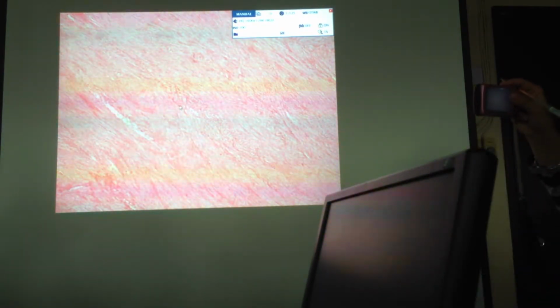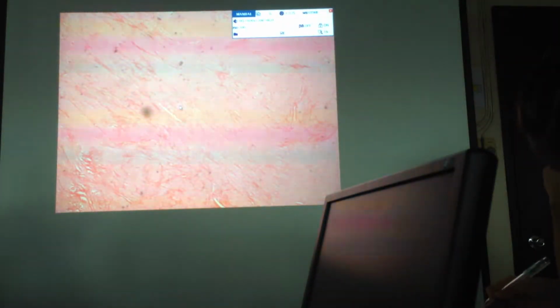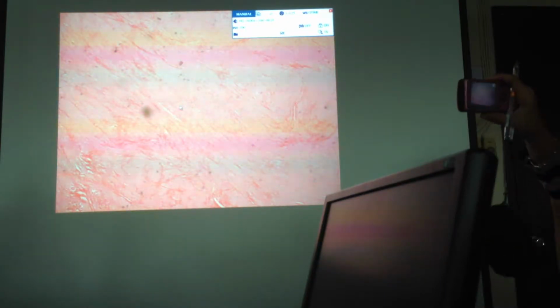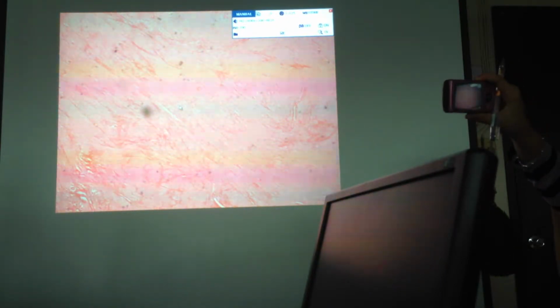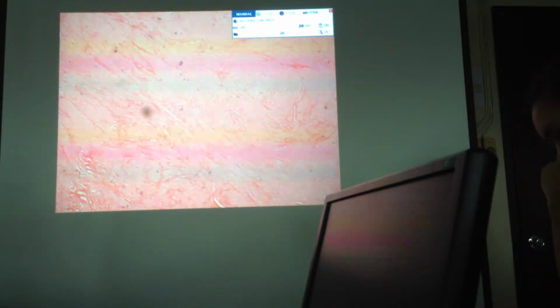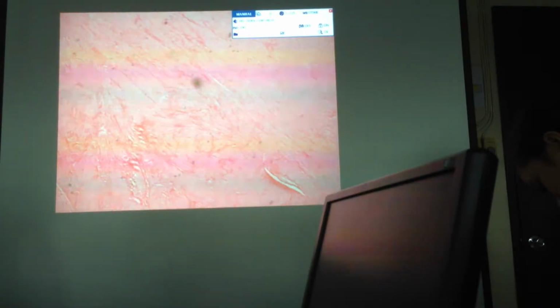So, this is a very common tumor, especially in females. Leiomyomas are hormonally induced. Okay? They can become big during times of pregnancy. That's why other females who are bearing their pregnancy, sometimes they have an accompanying enlargement of the myomas that they have prior to their pregnancy. From 1 cm, they become 10 cm. Okay, and then they can obstruct the pregnancy. Okay? So it can cause complications towards the baby and towards the mother.